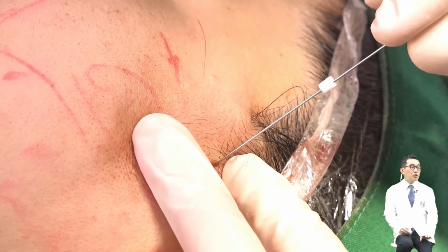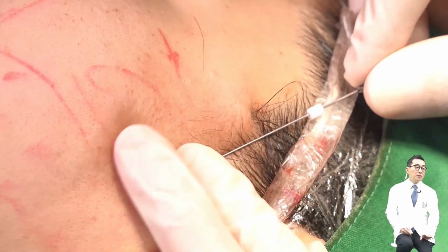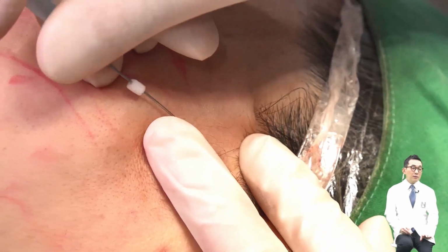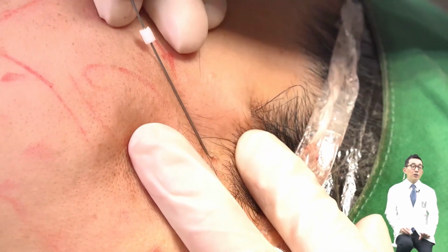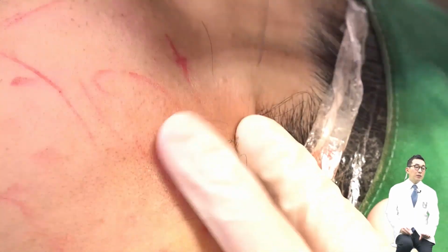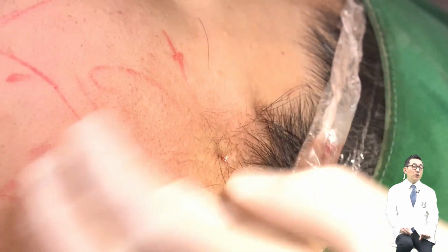Immediately after the procedure, there is a puncture hole. So through that hole, you can do subcision with a cannula or needle. Or if this is uncomfortable, you can puncture a new hole about 1 centimeter next to the dimple and do subcision with a cannula or needle.